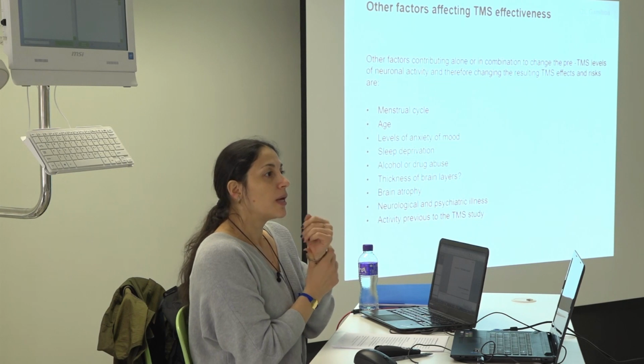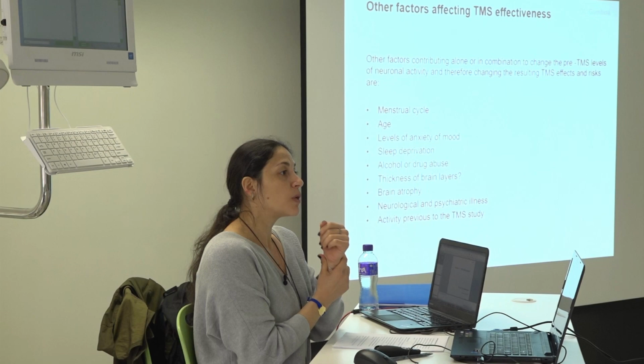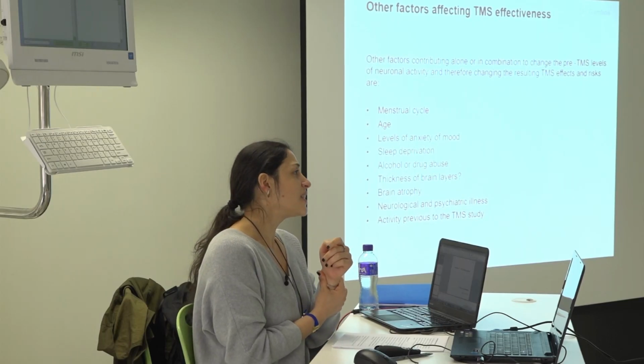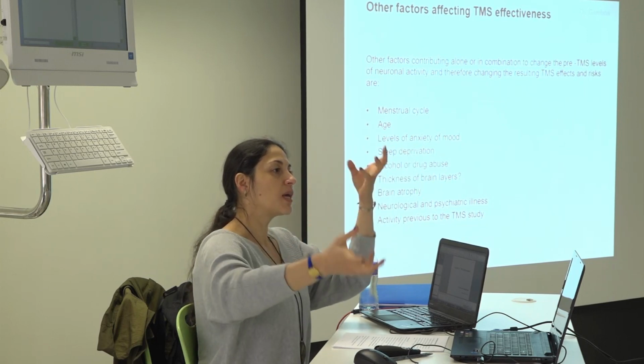But as I was saying before, many people say, why can't I reproduce your study? Well, because you are not reproducing it. Because in the labs I have been, they don't do TMS in menstruating women, but in other labs they do, and maybe, who knows, maybe this is a factor. And it's a factor because sometimes it's so difficult to find male subjects, and for TMS, mainly we have a lot of females coming. So you need to take this into consideration, and when you are doing your study, try to have balanced males and females.